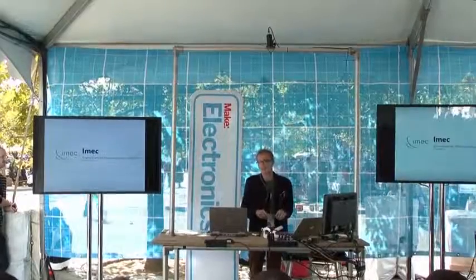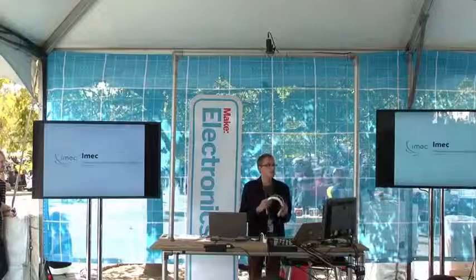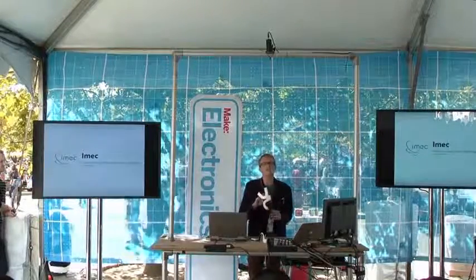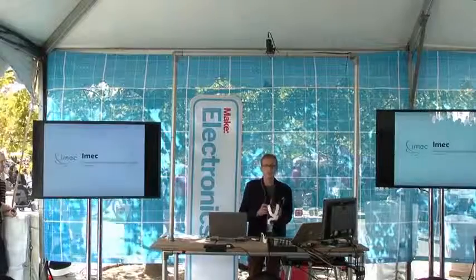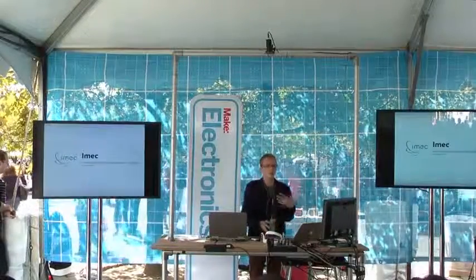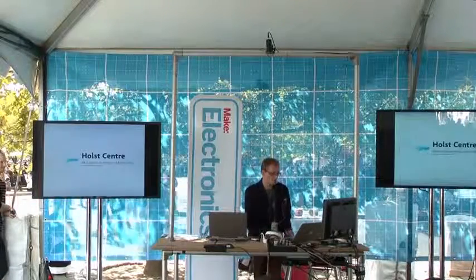The research they've been doing on this project was in this headset, which is a wireless EEG headset. And they focused on long-time battery use, because they wanted patients to be able to wear it a whole day, and the wireless connection, but we'll get to that later.